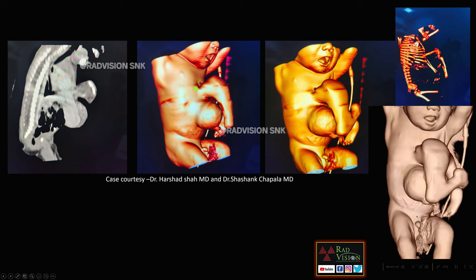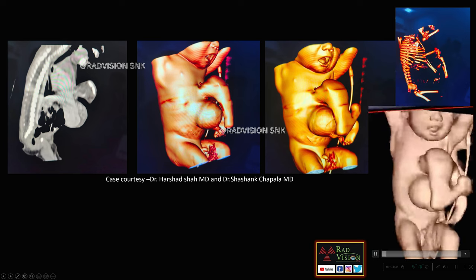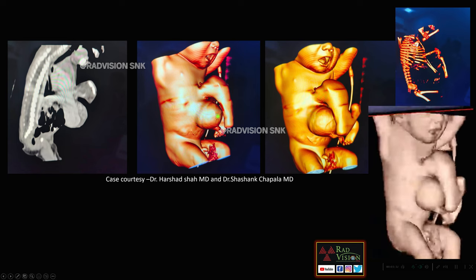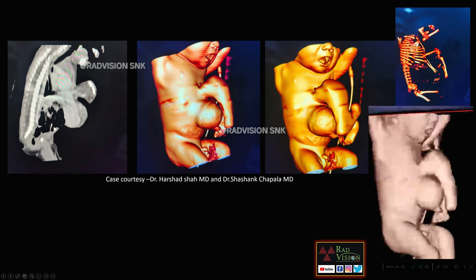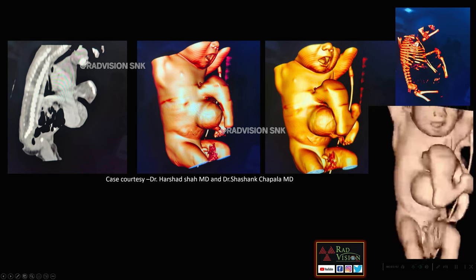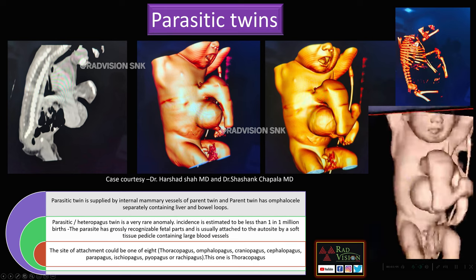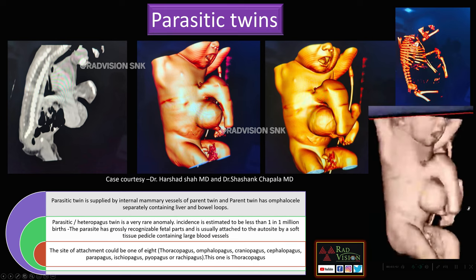Next case: here you can see a small projection-like structure arising from and attached to the thorax. This is a small limb-like structure attached to the thorax, and the parent twin has an omphalocele. On VRT reconstruction you can also see this classical limb-like structure attached to the fetal thorax. This is nothing but a parasitic twin, which is supplied by the internal mammary arteries of the parent.